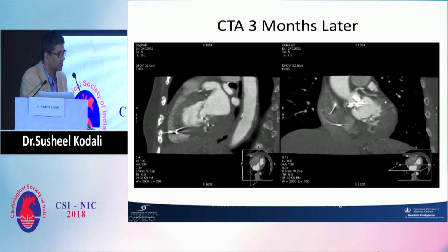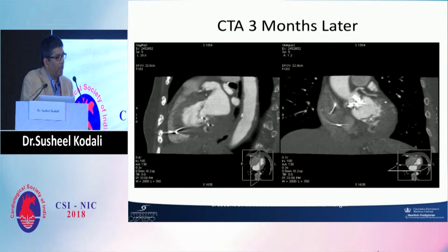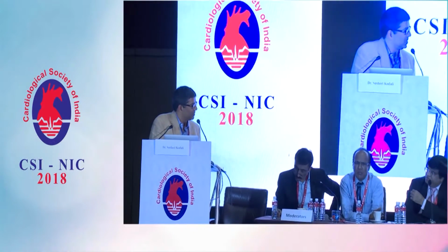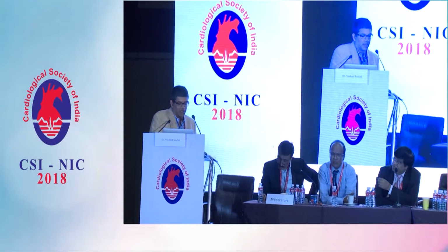I think it was a great presentation. Just besides this point, are you still doing TAVI in the USA under general anesthesia, or are you doing it with conscious sedation? Most of the patients are with conscious sedation at our institution, but I think it varies from place to place. I think either one is fine. You can make an argument for either side, whether it's awake or asleep. I think it's just being prepared for the complication.